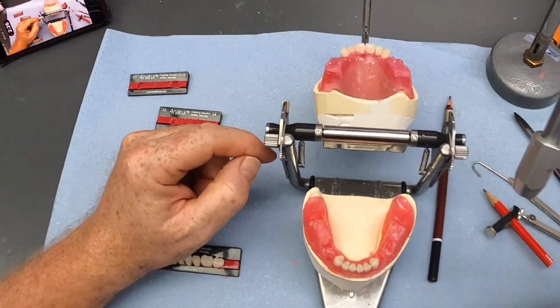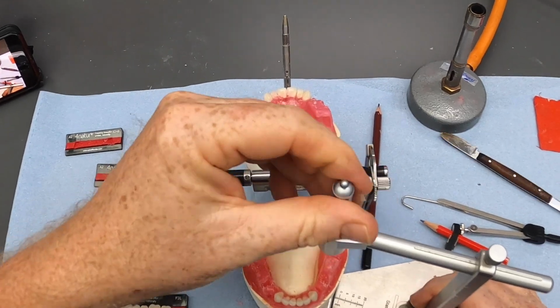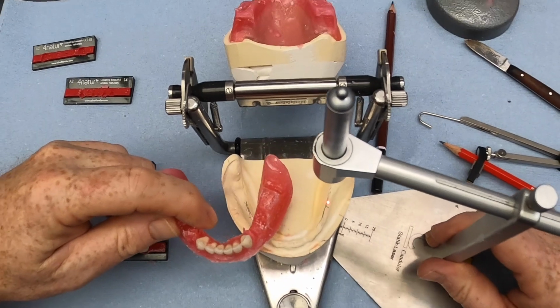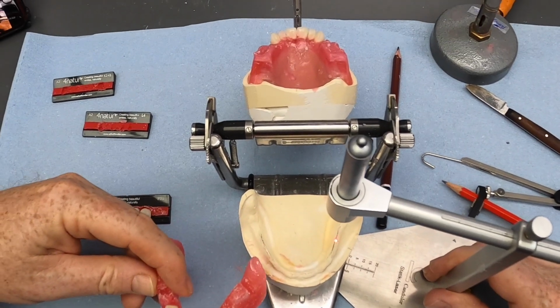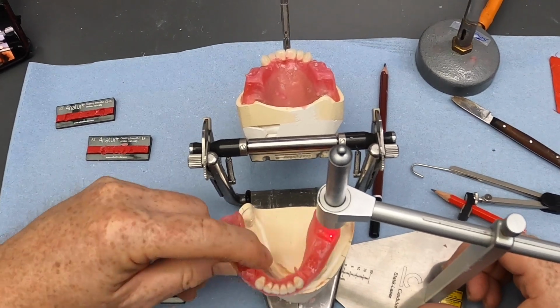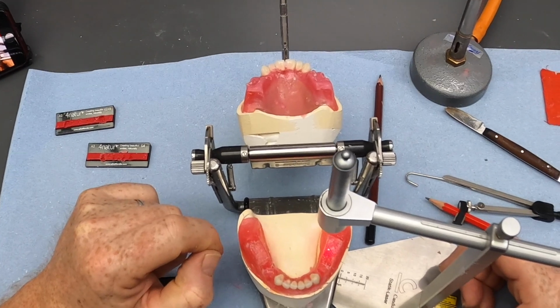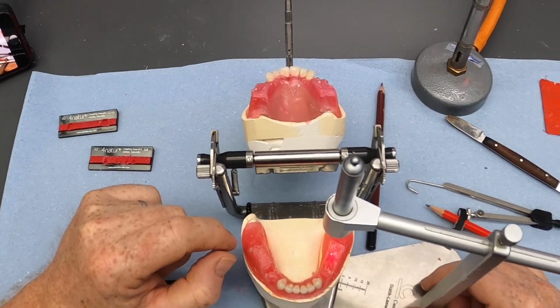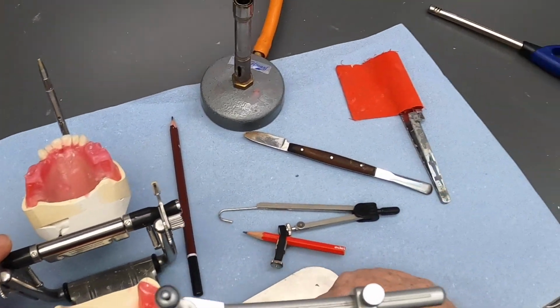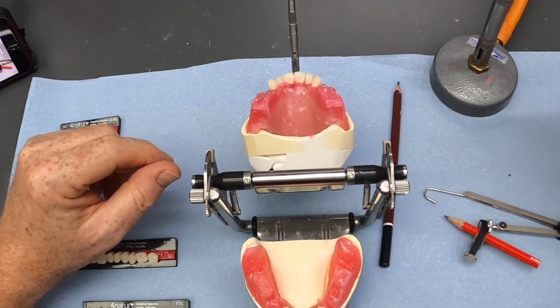Or if you're really fancy, you can get one of these gadgets which helps you locate where the tooth wants to be. So that hopefully you can see on here, I can locate my dot over the ideal position in terms of anatomy, put our rim on, and then we can position the central fossa of our tooth here in the rim. Anyway, not everybody has one of those. Pencil marks are as good, maybe not quite as quick or as flash, but as good really.